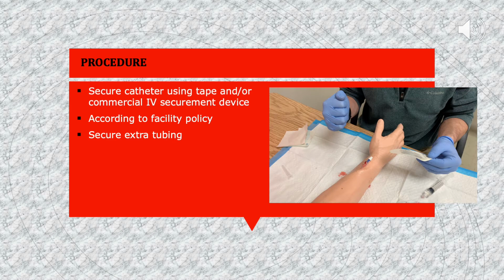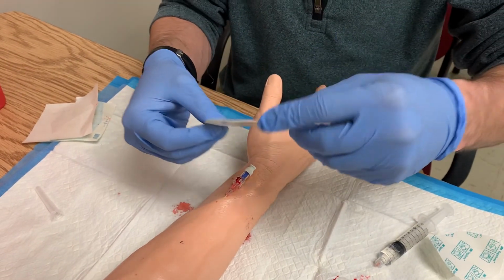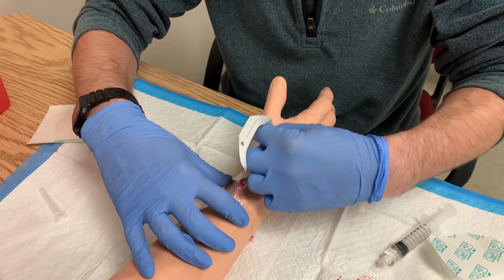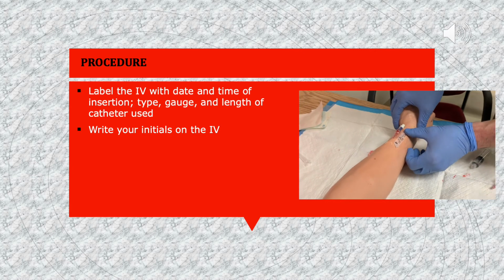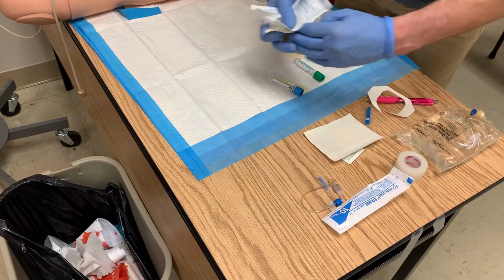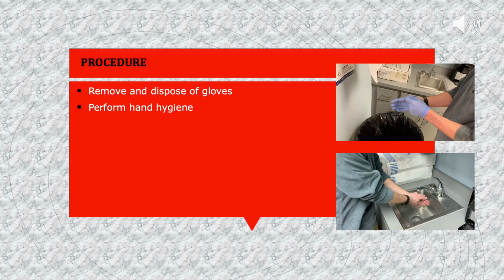Secure the catheter according to the manufacturer's instructions and facility policy. Secure extra tubing with tape as needed. Label the dressing with the date and time of insertion, type, gauge, and length of catheter used, and your initials. Discard of any disposable supplies, remaining sharps, or biohazardous material as needed. Remove and dispose of gloves. Perform hand hygiene.